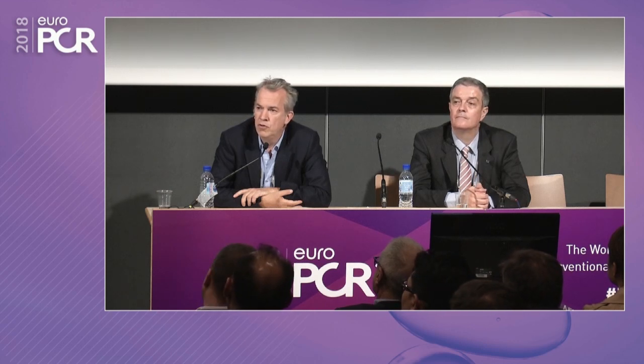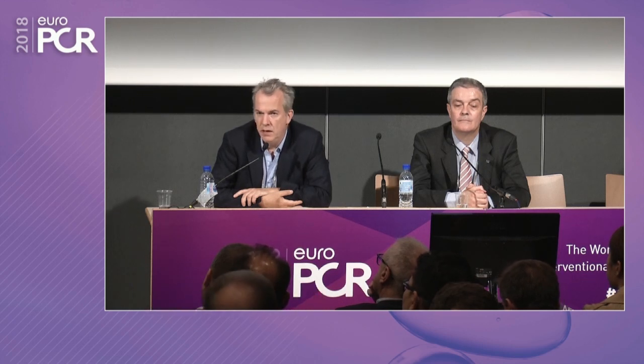Any comments on strategy or any particular things spring to mind? Yes? You will need two stents. You need a separate stent for the... Okay, mm-hmm. I think that's certainly something that they're going to need to consider. But of course, if the LAD is, let's say, 4 millimeters, then that particular stent, if you happen to choose the Onyx, for example, will go up to 5.5, even possibly 5.7. So it may or may not be necessary.